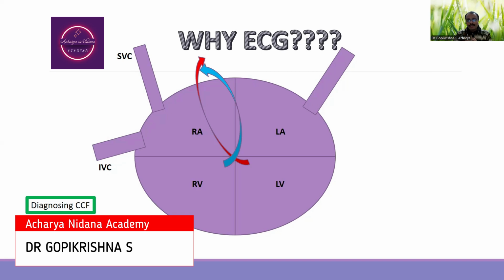Suppose the person is having mitral valve dysfunction, which can be identified by the systolic murmur that is present in the mitral area, which is radiating towards the left axilla, which is indicative of that. In that particular situation, if you are going to do the electrocardiogram, then there is a possibility of left atrial enlargement.